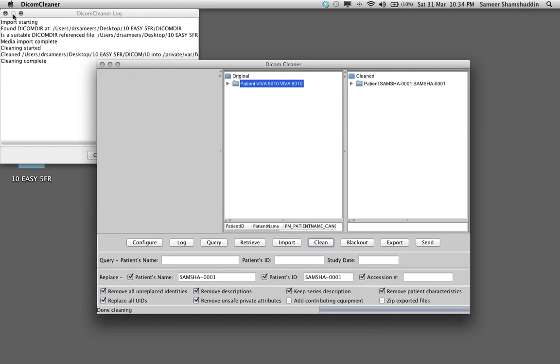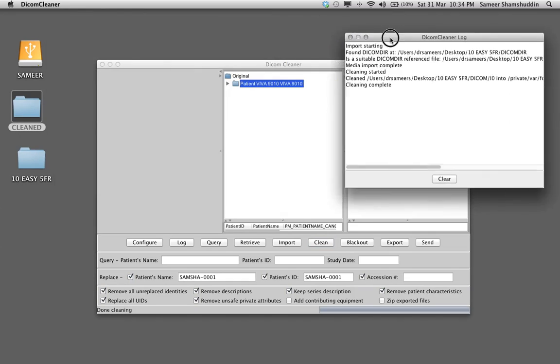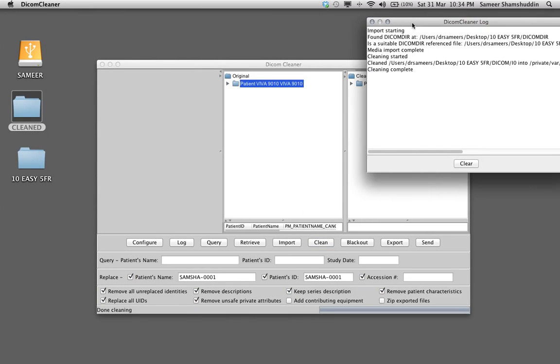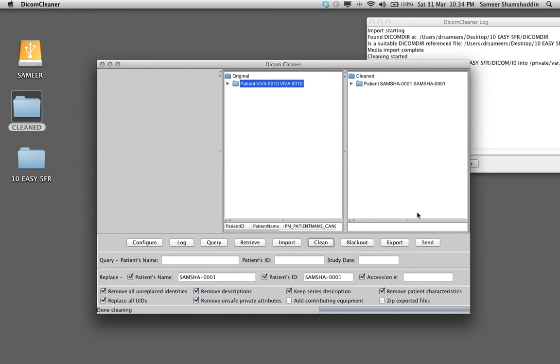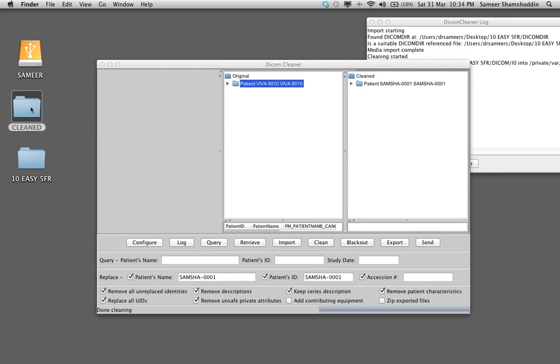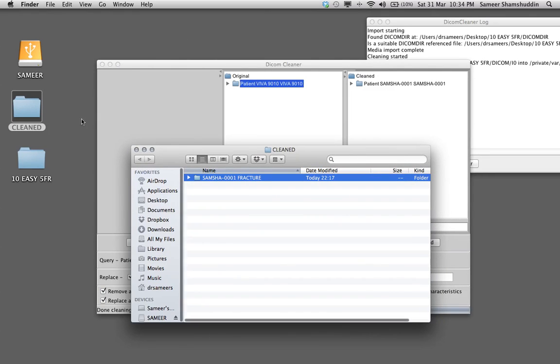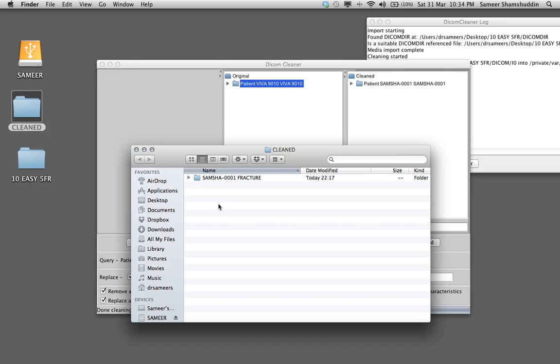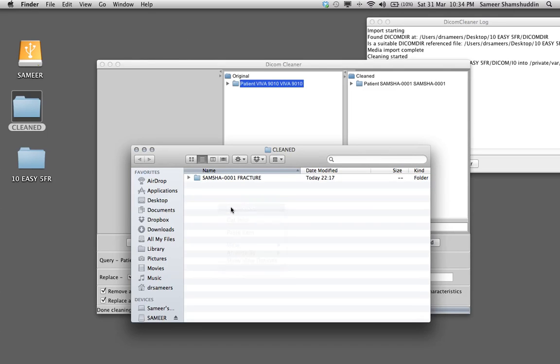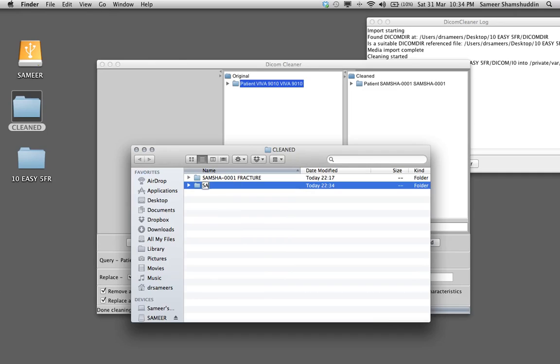It is important before you export the case you need to create a folder where to export. This is very important. So I have created a folder called cleaned on my desktop and then within this folder I will also create another folder called new SAMSHA-0001 cleaned and put the diagnosis so that you know what the case is.